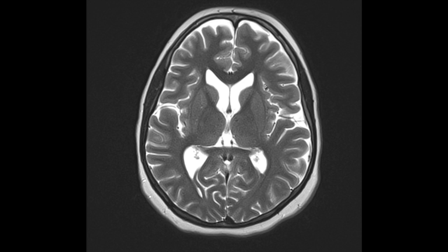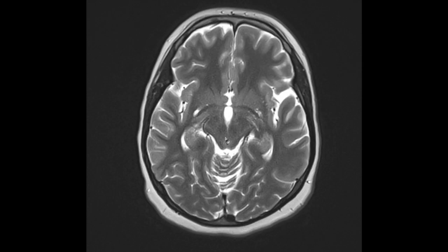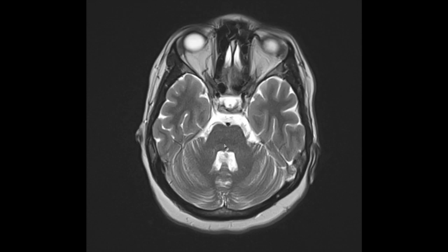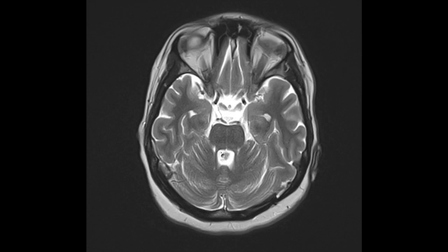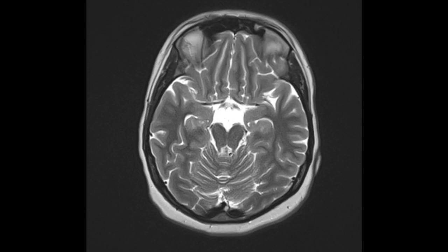Medial to the Sylvian fissure we have the insular cortex, which is considered its own entity in lobar anatomy. The lateral ventricles via the foramen of Monroe form the third ventricle, and then coming down you end up with the fourth ventricle via the cerebral aqueduct.